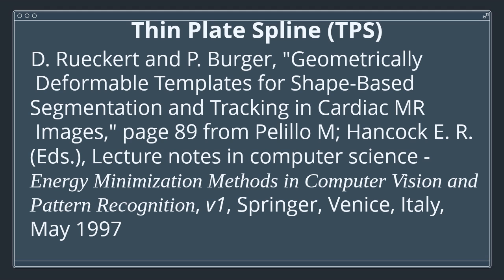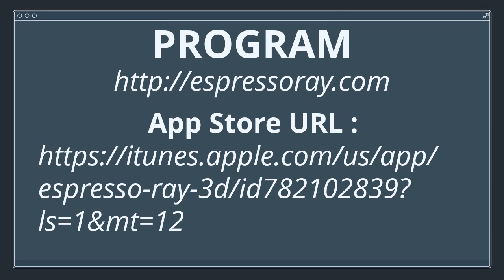As I pledged earlier, here's the information you'll need to get the program. It offers a ton of graphics work, including both uniform affine and non-uniform TPS deformations, plus another bunch of graphical properties that I'm not the one qualified to describe. The benefit it offers to you is very easy to describe. You can use the program to process your own landmark data from any other anatomical site. It is our genuine hope that this work, a collaboration from 3 individuals in 3 very different areas, will make life easier for many through improved diagnostics in 3 dimensions throughout.